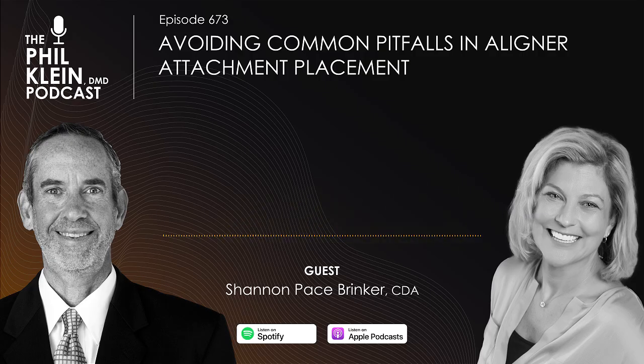Train the team right to really isolate the entire mouth with a good isolation retractor, and you really don't have to cut it and worry. If we train them correctly out of the gate, then we won't have to worry about touching it. And again, that template is sacred, so I don't like to alter it. Some people say they'd use oil or Vaseline around it so you make sure we can clean up the flash, and I'm like, oh my gosh, no, contaminants. Just out of the gate, train the team to have good isolation first.